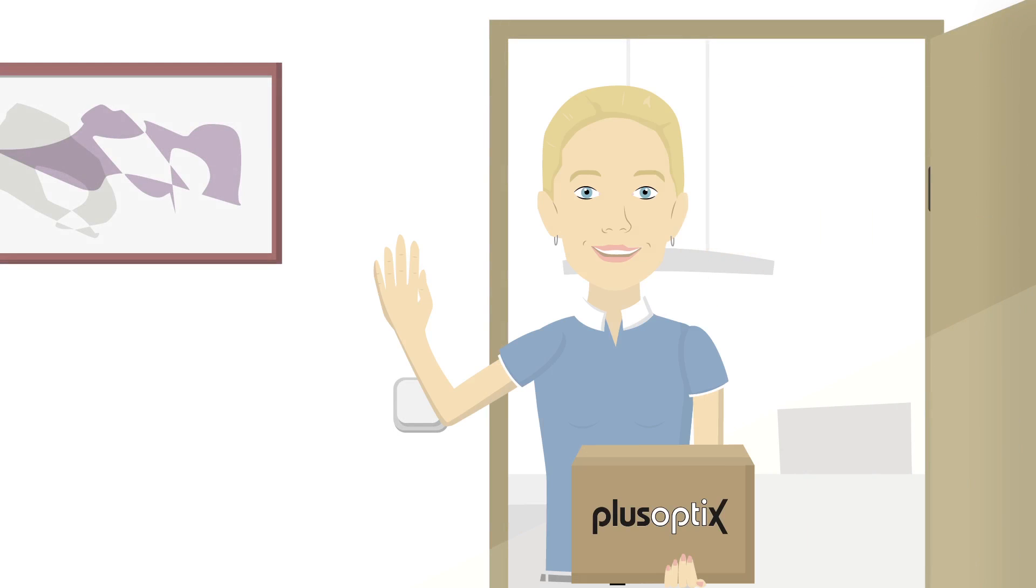Hello! This is Anna. Her new PlusOptics S16 Vision Screener arrived today.